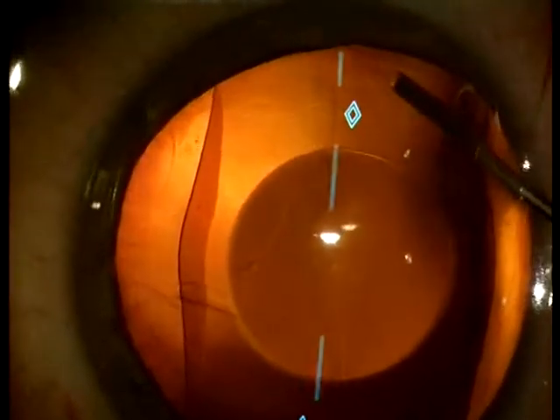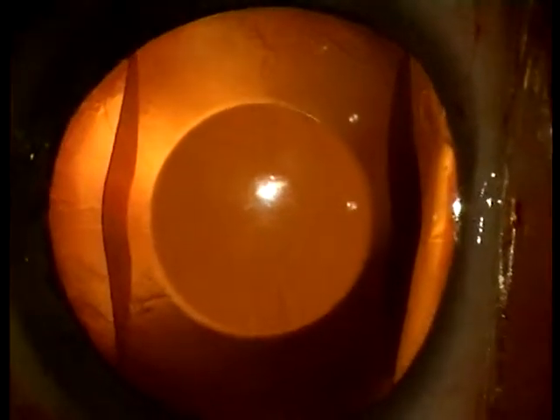At the end of surgery, the diamond-shaped markings on the toric ICL are aligned with the epithelial indentations which indicate the horizontal axis. In this way, the astigmatic correction in the optic part of the lens is aligned with the cylindrical error of the eye.